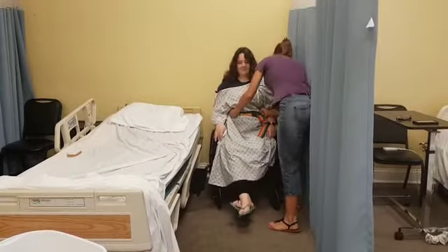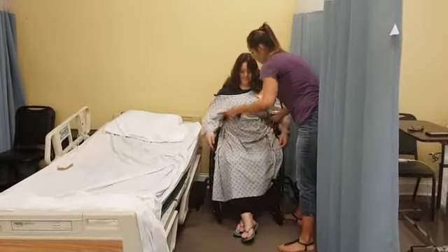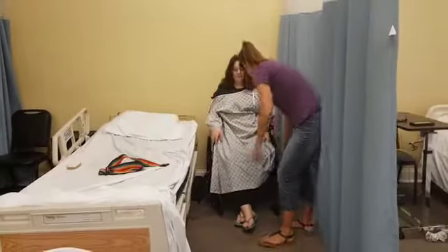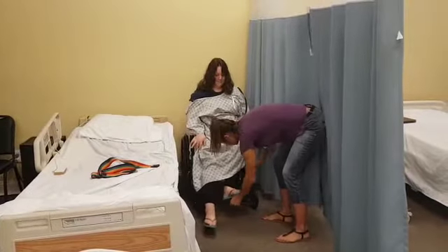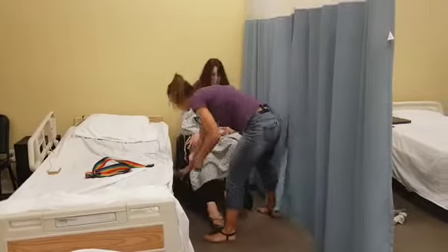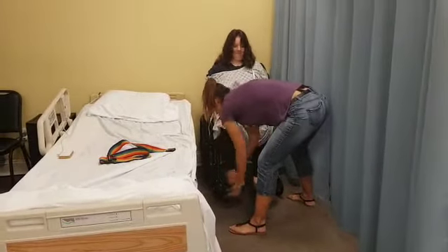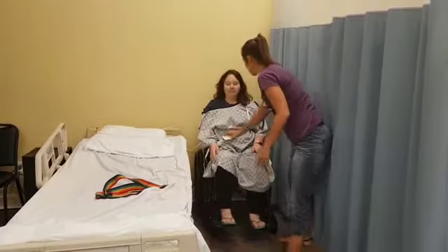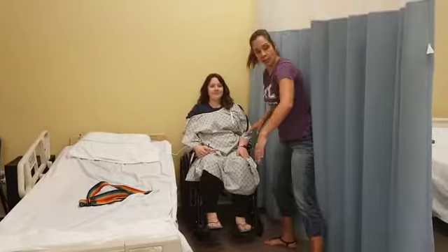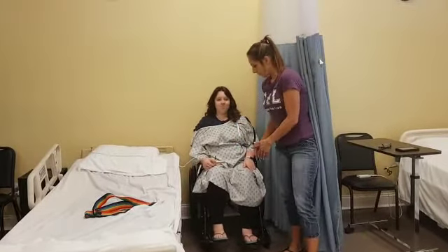All righty. Your hips and your bum all the way back. We have to verify that their hips are all the way back. Take off the gait belt. Put your feet up in the footrests, which is showing that we know how to put them in a wheelchair safely.